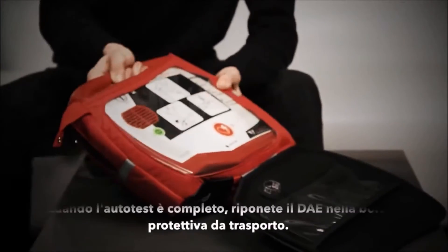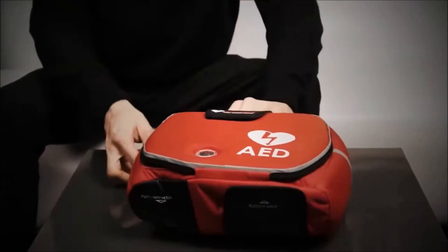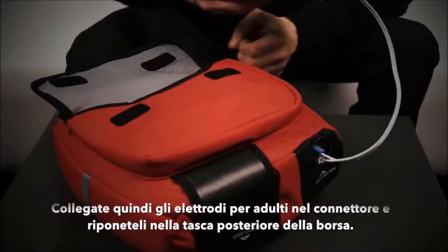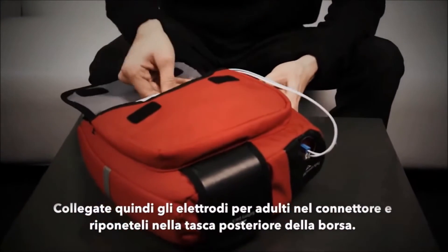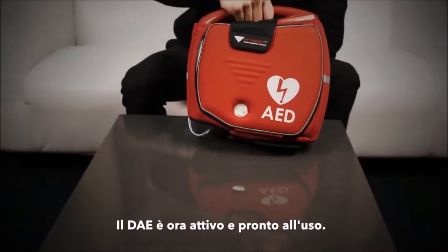After the test is complete, slot the defibrillator into the protective bag. Connect the adult pads and slot this into the accessory pouch. The defibrillator is now set up and ready for use.